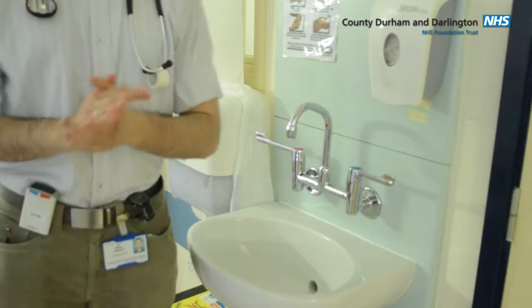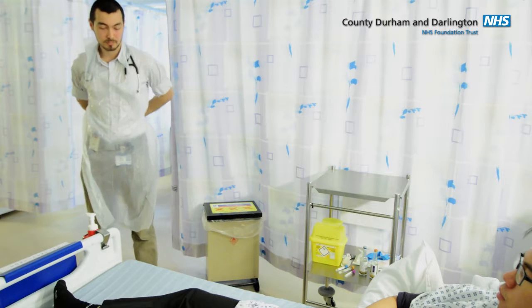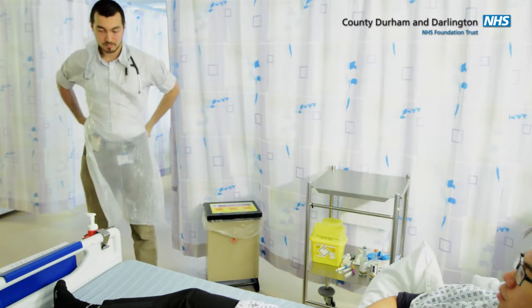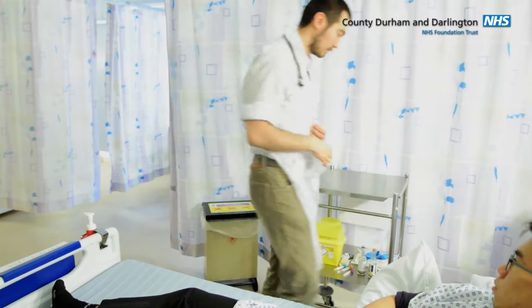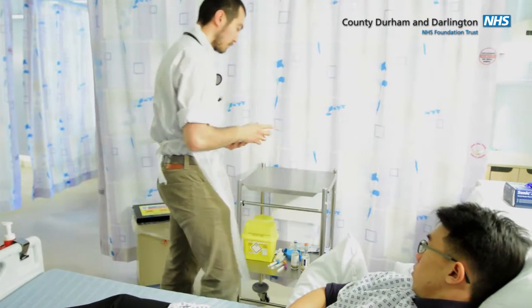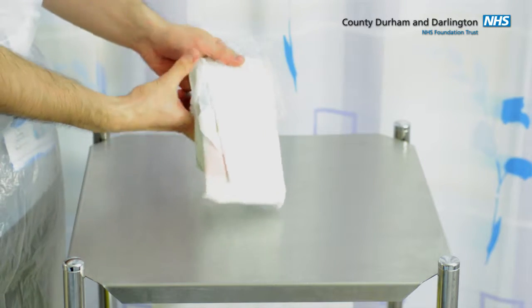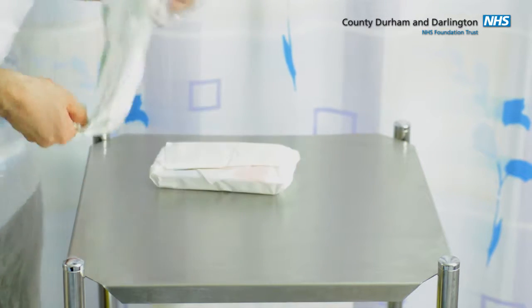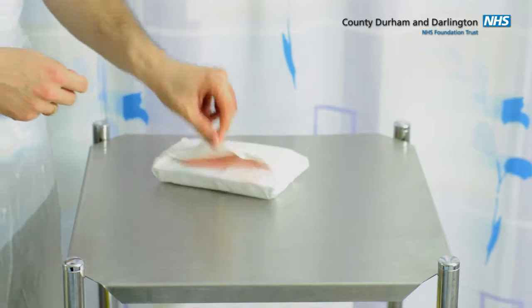After your hands are dry, put on your apron. Firstly, open up your sterile dressing pack onto the top of the trolley. Open up the dressing pack as carefully as you can.